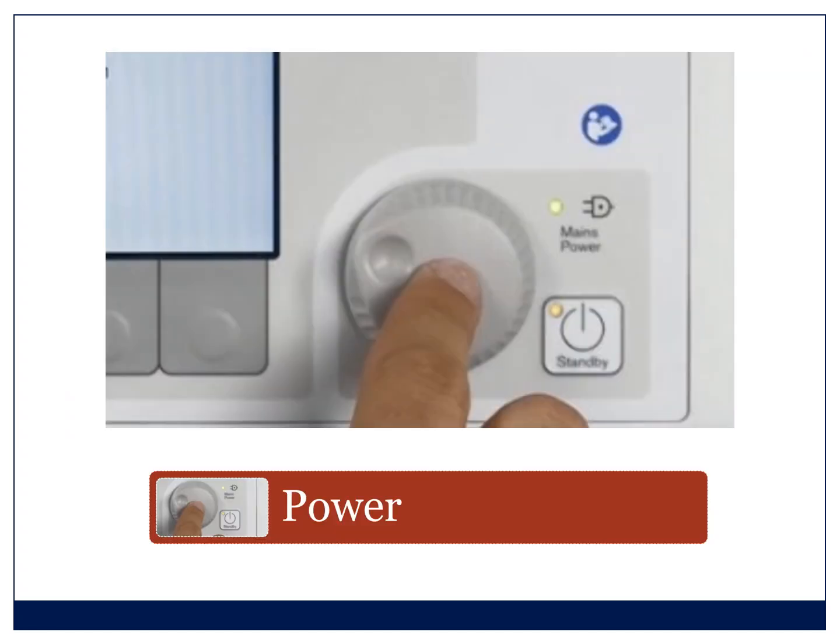So just to go into a little bit more detail, when you're checking the power, you need to know where the light is that says the power is on. And you can see that little green light is there to say you're on mains power. Now, it's quite often the machine is on, but you're actually running on battery power. One of the ways to check it is just to go to the wall, switch the plug off, and then come back and see now what light is showing. But remember to turn the power back on. Make sure you're on mains power and your batteries are charged.